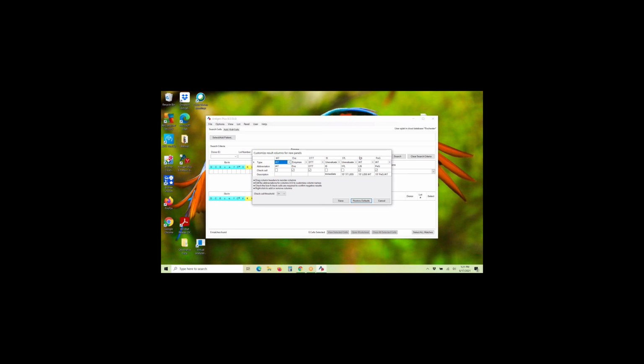So that's why they're unevaluated. Our other columns are pretty much all IAT, including enzymes and DTT. And if you're using enzymes and DTT, just know that the enzymes are not going to rule out things that are destroyed by enzymes, and DTT is not going to rule out things that are destroyed by DTT. So don't pick those types of columns if you just want to do a general rule out.